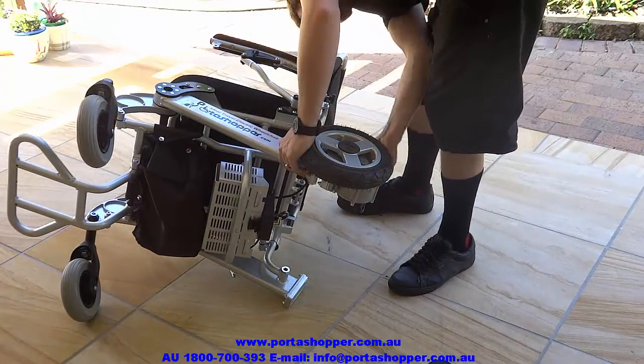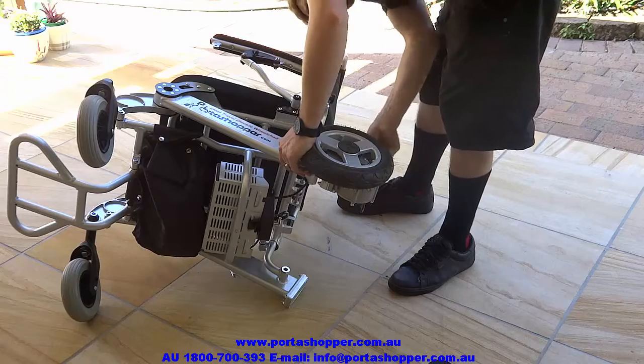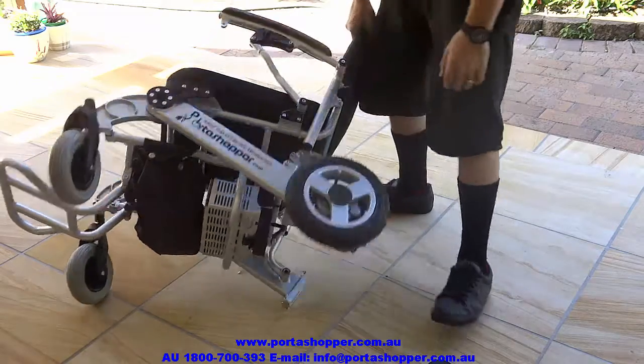which, as you can see, makes it easy for anyone to disassemble the wheelchair into three components within a minute.